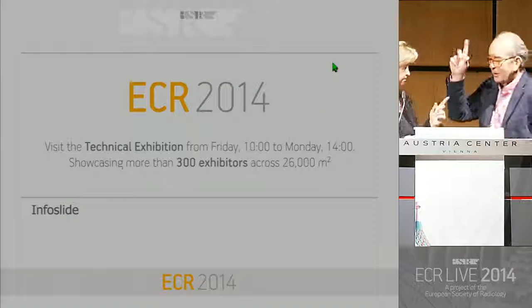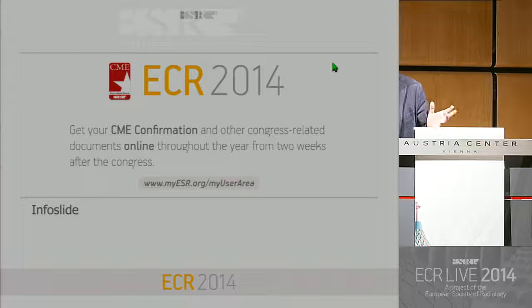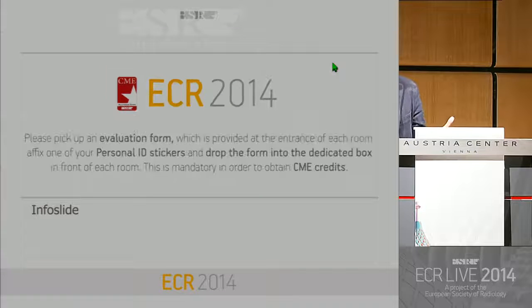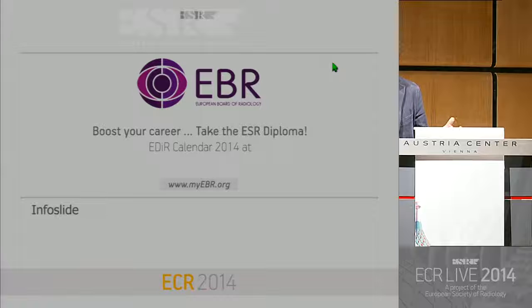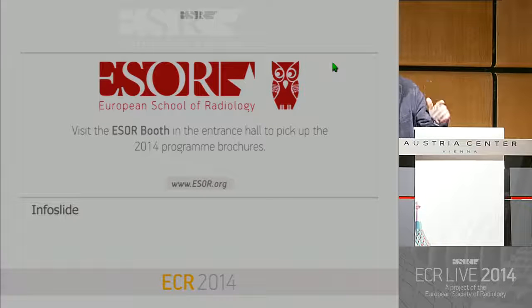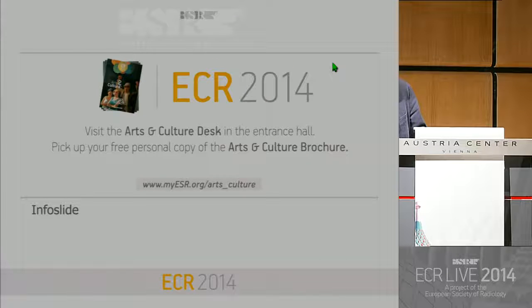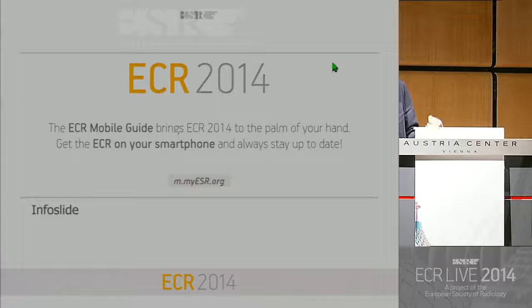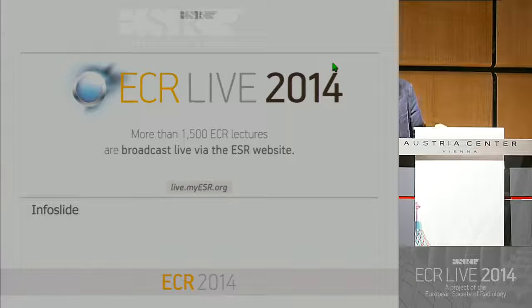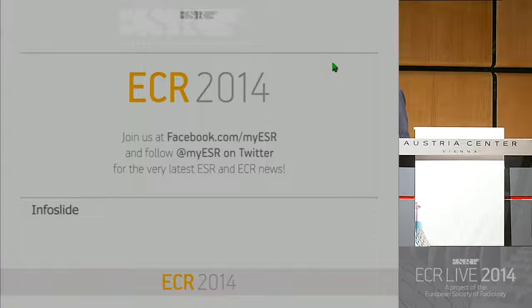I have something to say about the utility of MRI in patients potentially included in active surveillance. It's not fun to include a patient in an active surveillance protocol if the MRI is done after the biopsy. You have so many artifacts that it's not worth doing. If you want to do it, you start with an MRI. If you still want to perform biopsy on everybody, okay. But to assess the true negative predictive value of MRI, you need to do it before biopsy. Would you agree with that? Okay, please, go. Thank you.